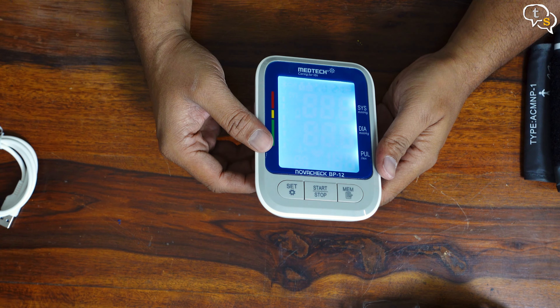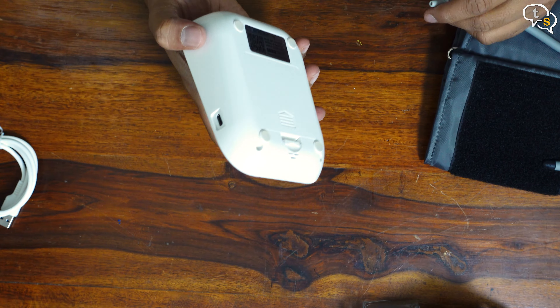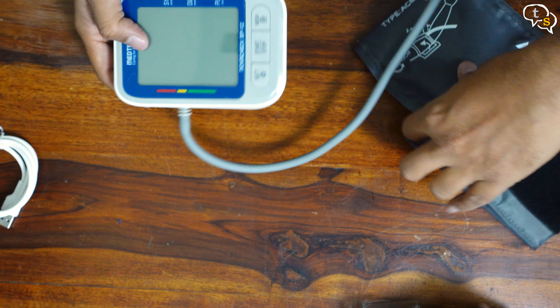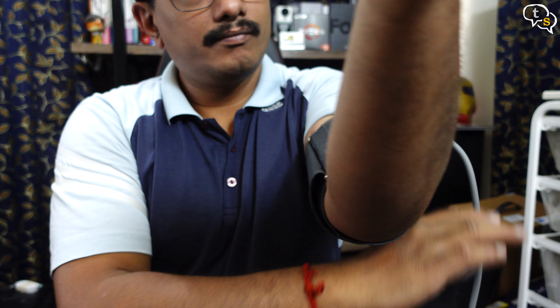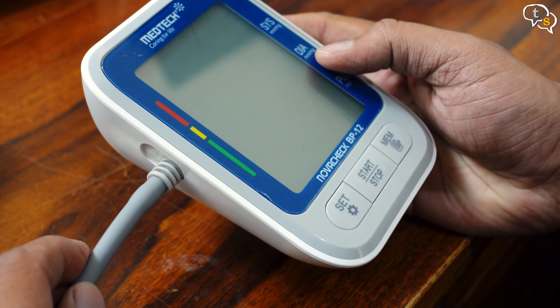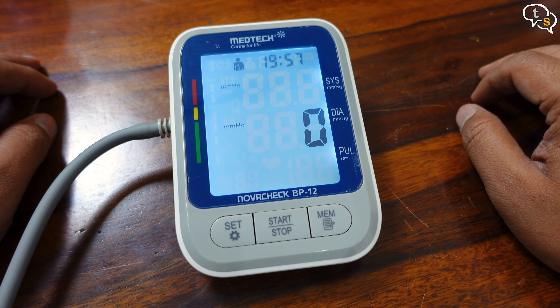I'm just setting up the date and time — it's ready. Now for the cuff. We have this connector here which via a pipe connects to the cuff. Place the BP monitor on the table and set the cuff upon your arm, using the velcro to fasten it down. It should fit most arms and you should leave a finger gap between the cuff and the arm. The connector connects to the port on the side of the BP monitor. Once connected, the setup is done — hit the start button.